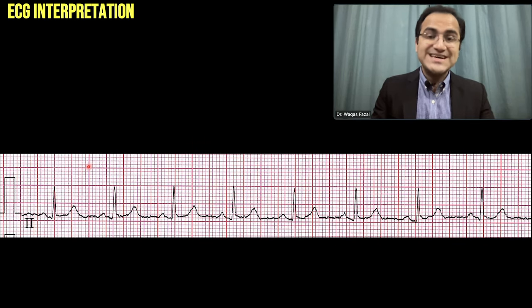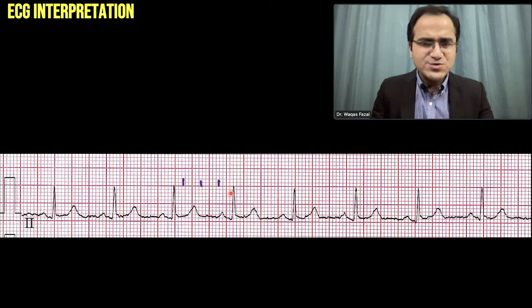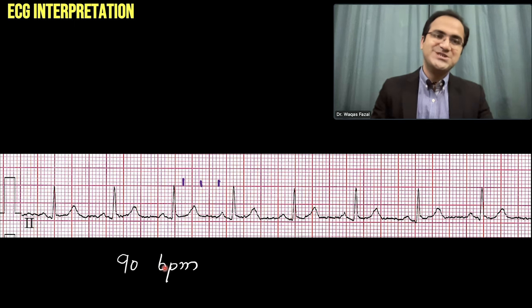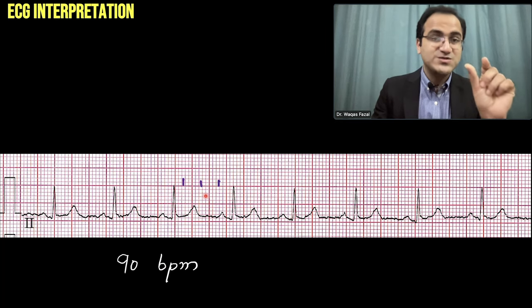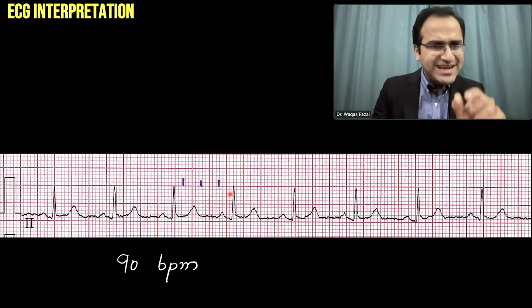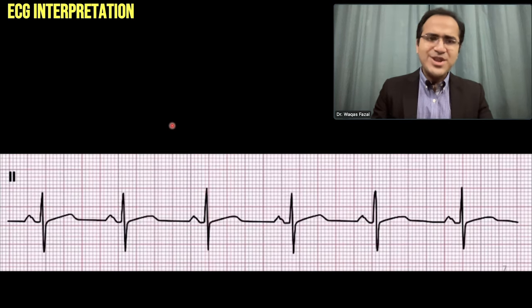Calculating rate by square counting on this ECG: counting the squares — one large square, two, and almost two-thirds of the third. So: 300, 150, 100, and a little less than 100. We call the rate approximately 90 beats per minute. One box = 300, two = 150, three = 100, and with a bit extra past three we estimate 90 beats per minute.